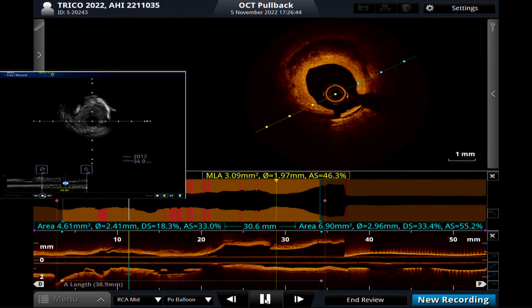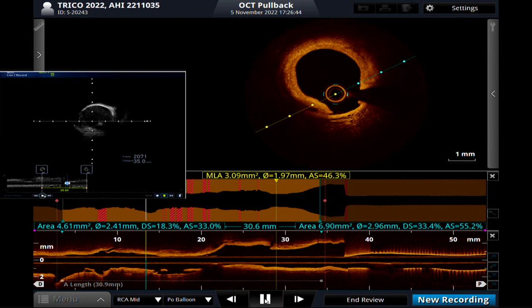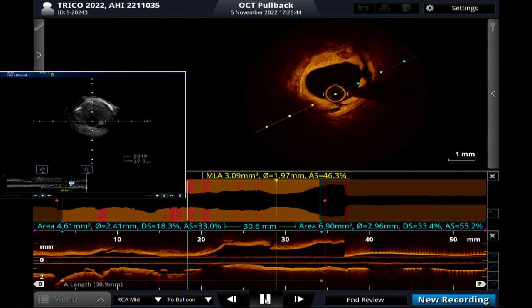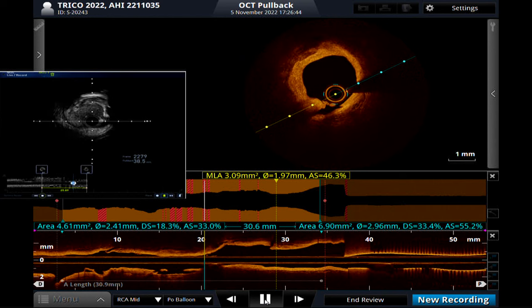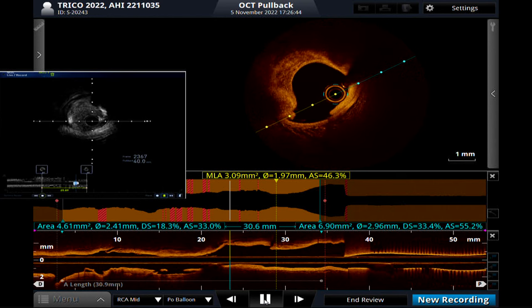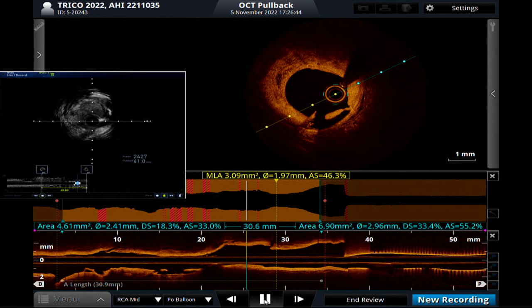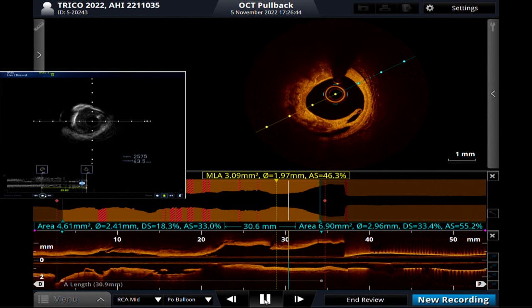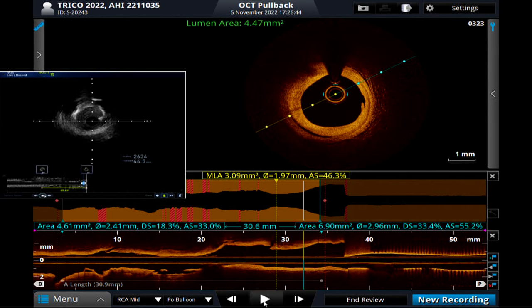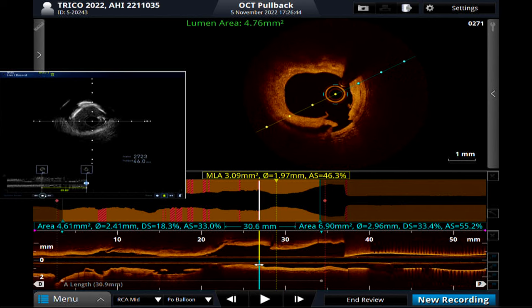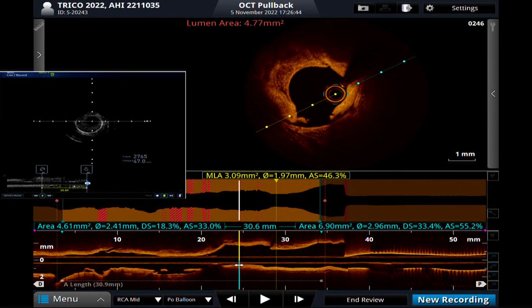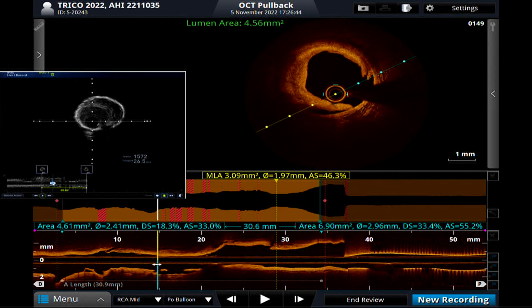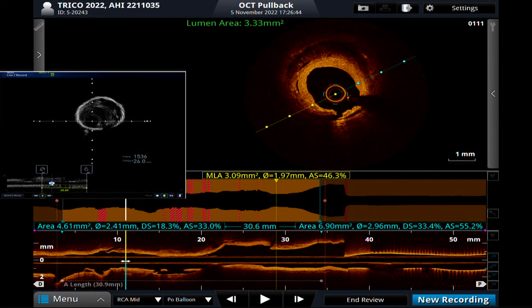Dr. Akasaka, do you see any difference in sizing with IVUS versus OCT? In our experience, OCT is very accurate even compared to the phantom model. IVUS makes measurements about 7 to 8% bigger than the phantom model. But IVUS sensitivity to identify calcium should be better because we can identify deep calcium — acoustic shadowing is very obvious.